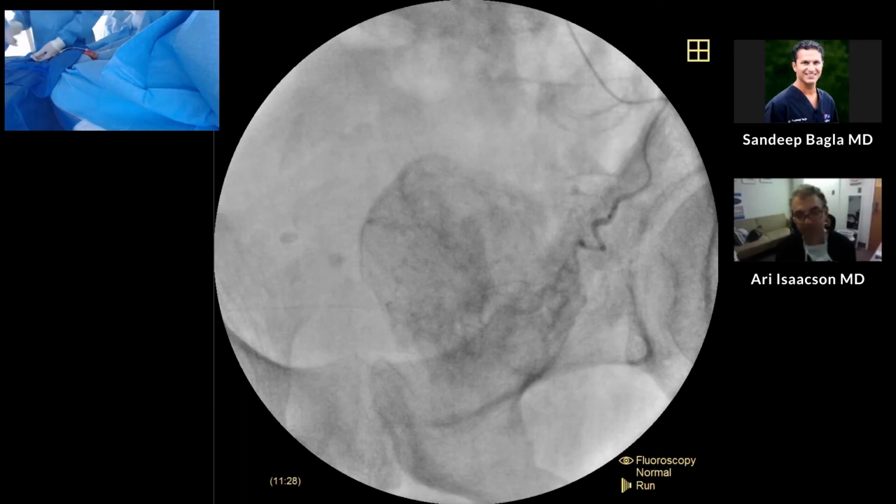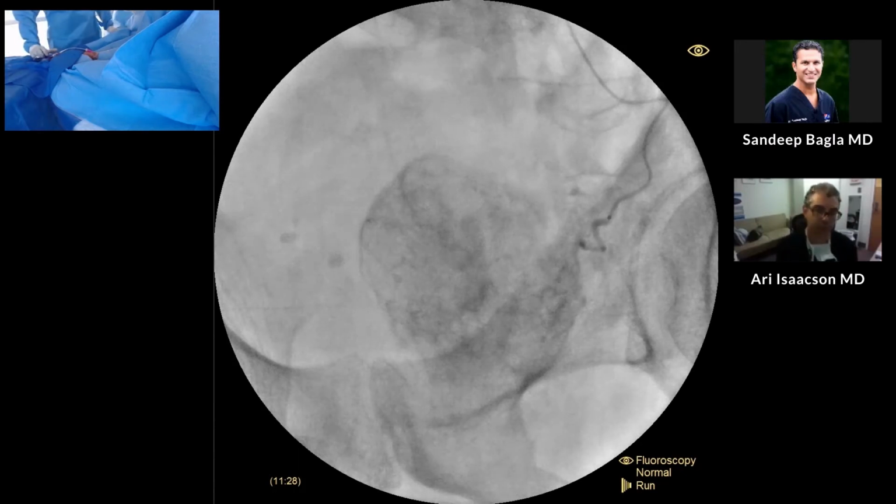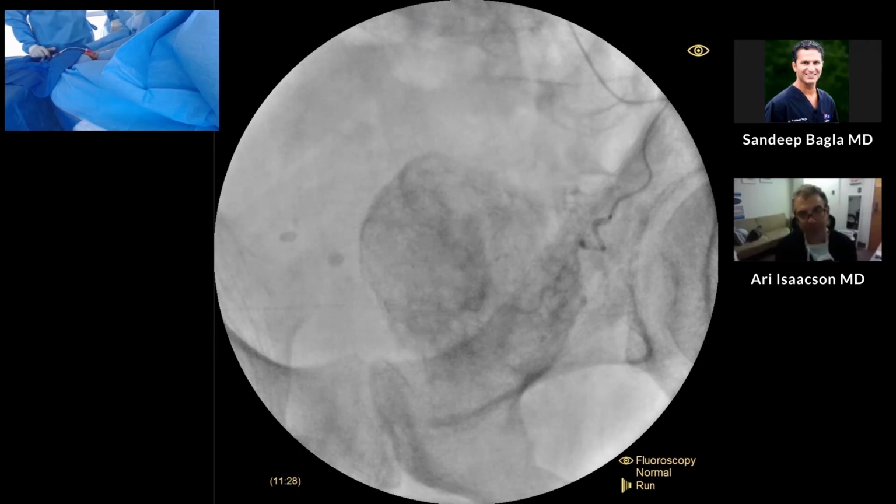One of the things I'm doing here is, you can tell we got pretty good stasis already with these particles, and sometimes we'll finish up. I know you're a fan of this technique too: sometimes we'll put a little gel foam slurry or paste in afterwards. What I found is, we use a 1cc Medallion to get it through there because obviously that paste can be very thick, and you'll see it here coming out in just a second. But with this catheter, I've not seen any difference in the ability to do that, even though we've also gone to a 2.0 French catheter as well. Have you noticed any challenge with that? Here it comes. Here's that gel foam coming out. You can tell by the increased density, and this will be completely static here when we're done.